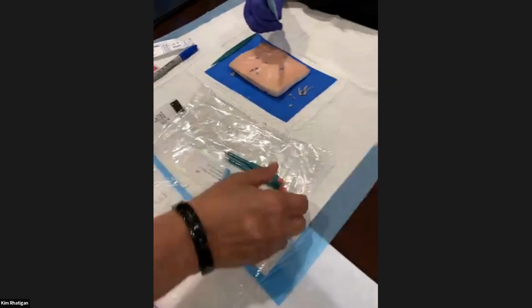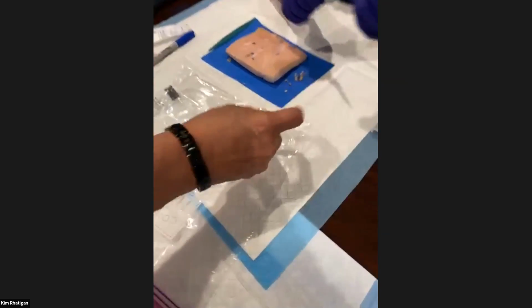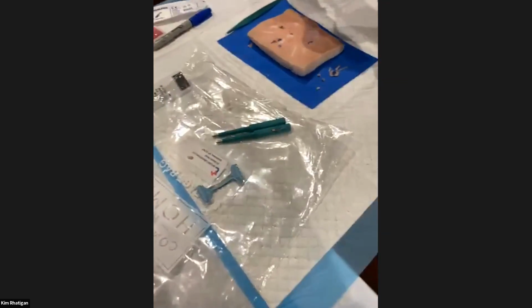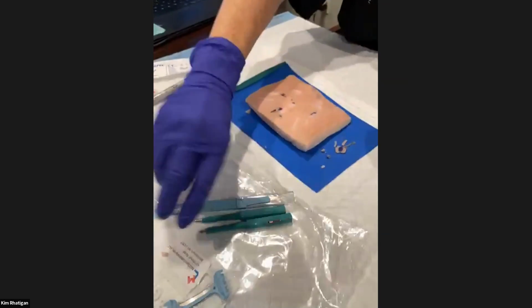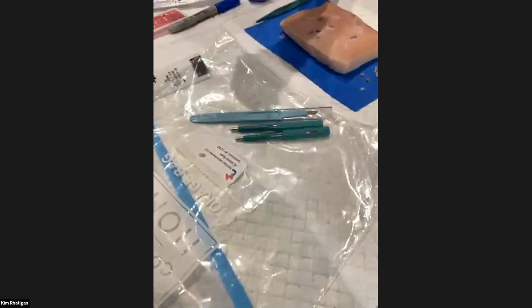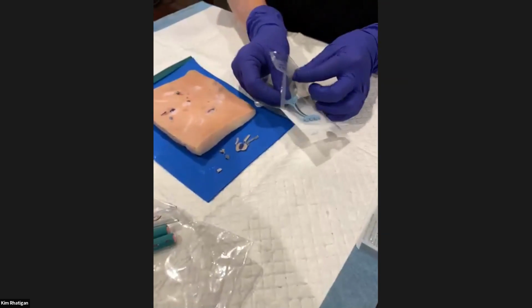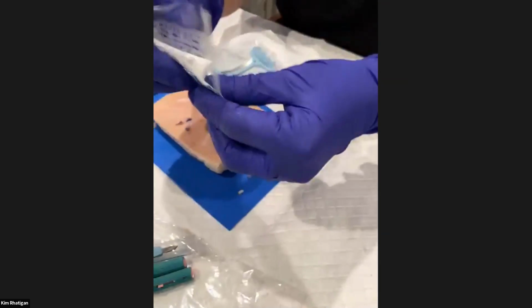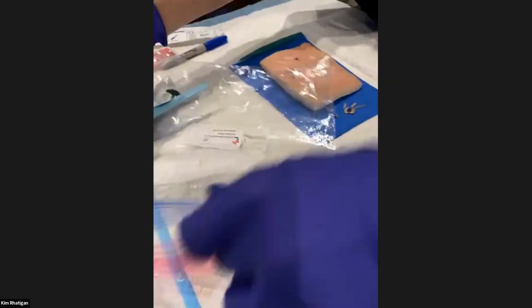Now, one thing you can do is push the safety in on the punches. There are 2 tools that won't cut you. So now I put the cover back on this. And this, I actually would probably put in here, because God forbid a sibling or somebody at your house mucks around with your stuff. And I would put this all back in the bag like this. The only thing you're missing is 1 sharp.